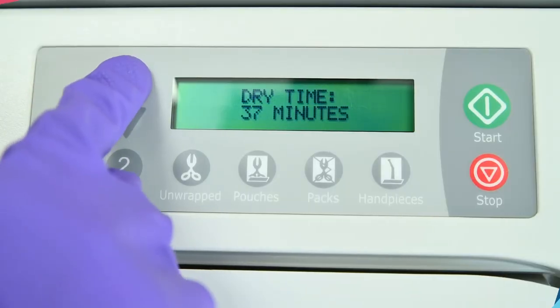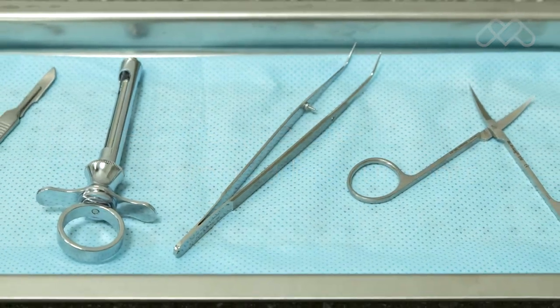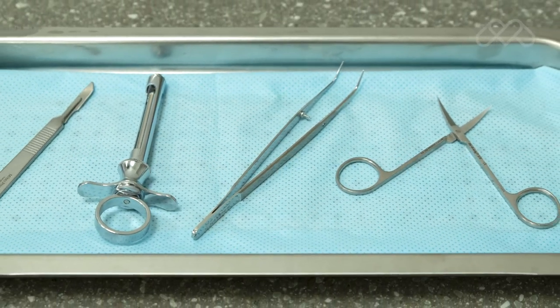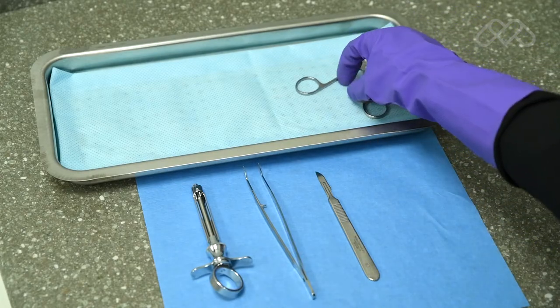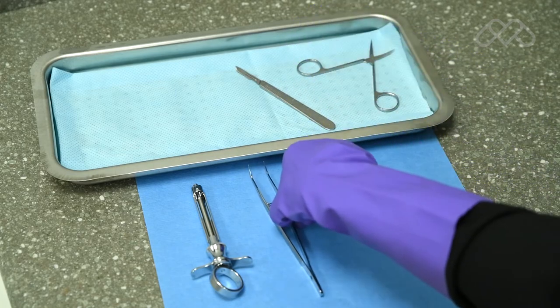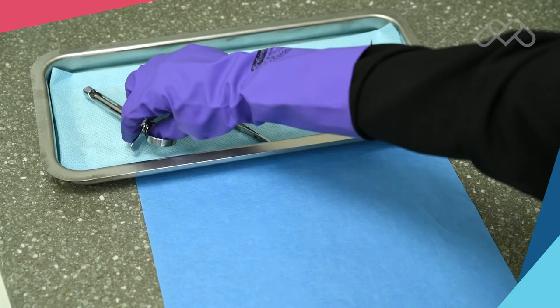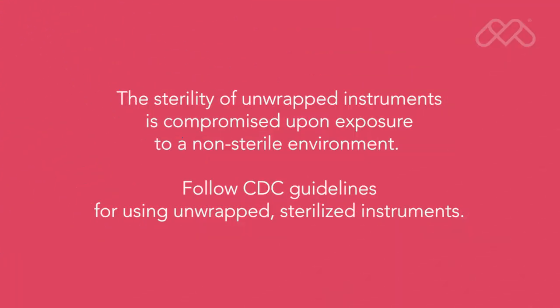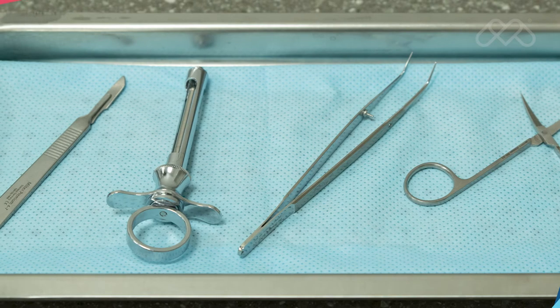Additional dry time may be required. M9 and M11 steam sterilizers are capable of sterilizing unwrapped instruments for immediate use. Place a surgical cotton towel, paper tray liner, or a folded CSR wrap in the bottom of the tray. Arrange the unwrapped items on the towel so they do not touch one another. The sterility of unwrapped instruments is compromised upon exposure to a non-sterile environment. Follow CDC guidelines for using unwrapped, sterilized instruments.